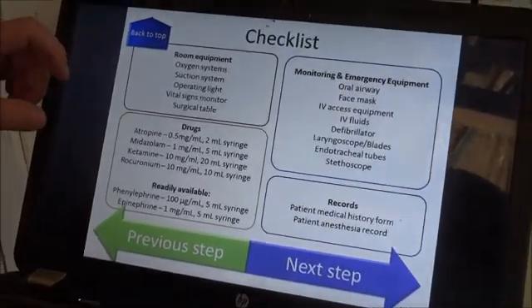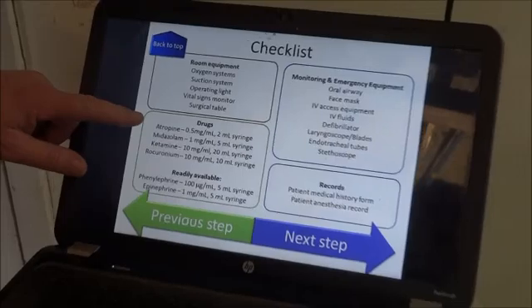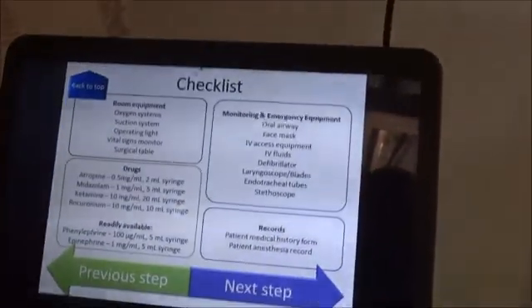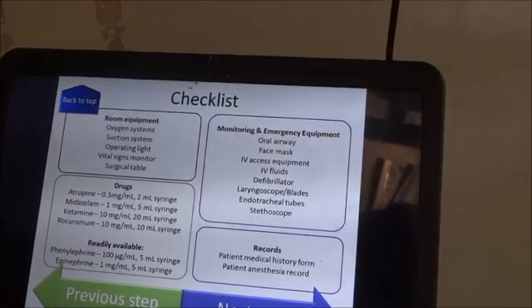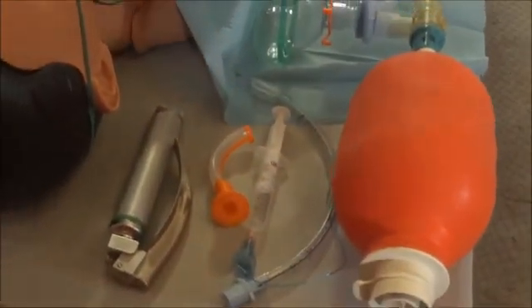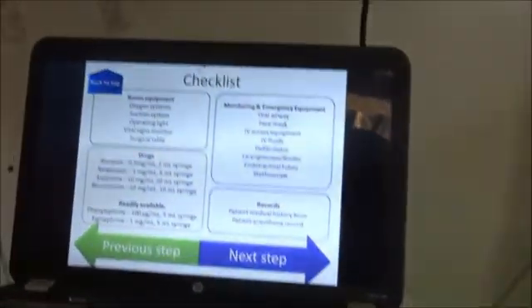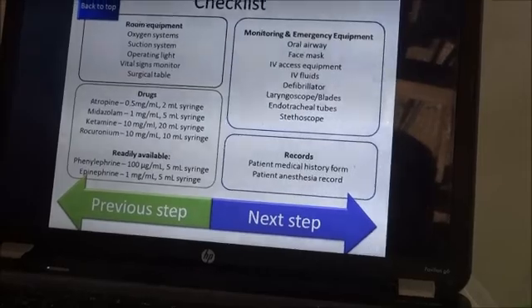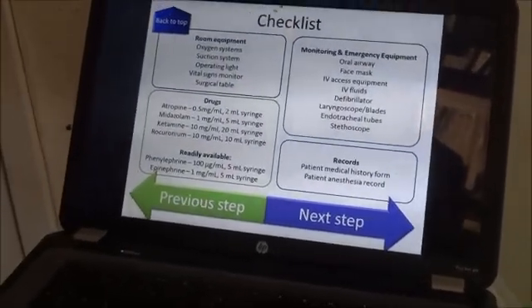Then we need to make sure all the drugs are ready. This has been previously prepared, and the drugs are here on the plate, ready to be injected. Then we need to make sure the monitoring and emergency equipment is ready. This has been done previously, and everything is in place close to the head of the operator. The medical history form and the patient anesthesia record are also available.